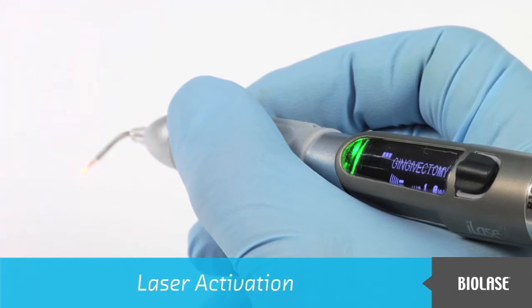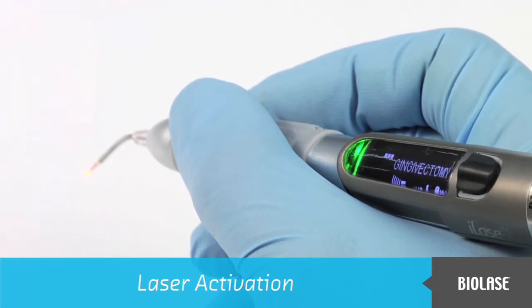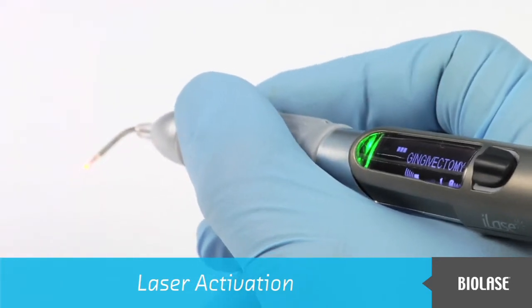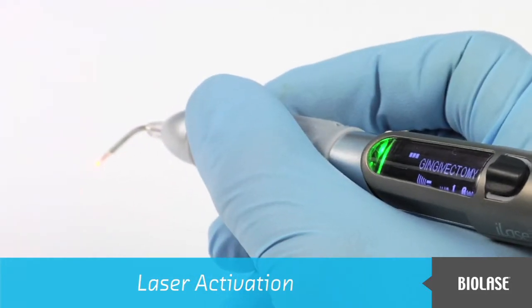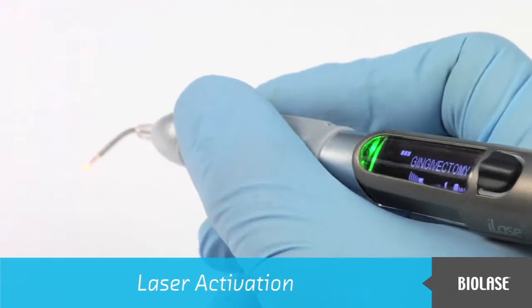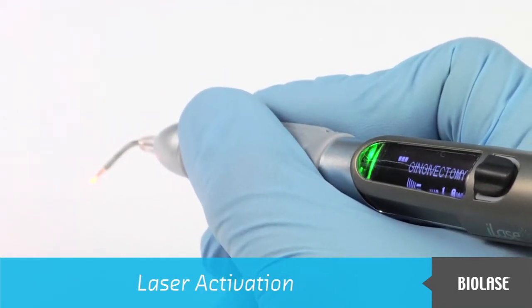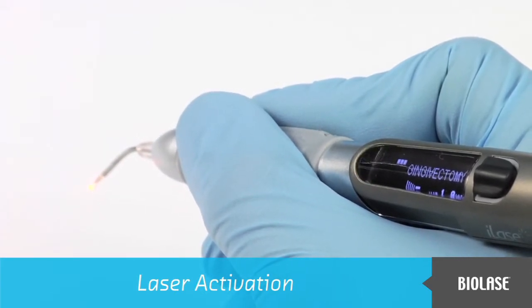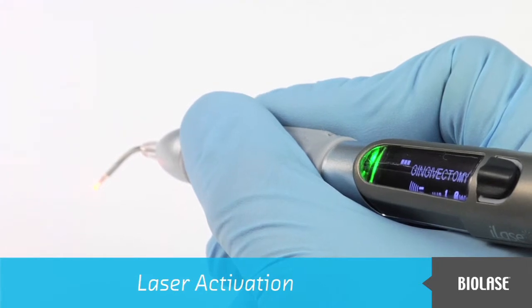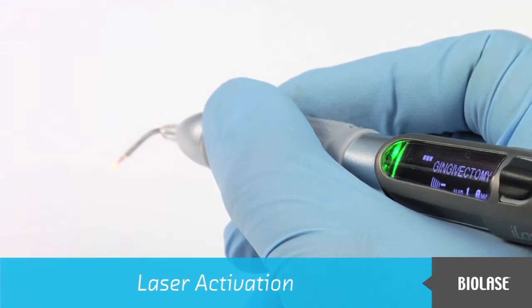Any portion of the finger switch can be pressed and held to activate the laser. For safety purposes, the laser does not immediately activate when the finger switch is pressed. When you press the finger switch, you will hear an immediate beep tone, but the laser will not yet activate until you press the switch for approximately 1/3 of a second. When the green LED blinks and the beep tone pulses, the laser is activated. To stop the laser output, simply release the finger switch.